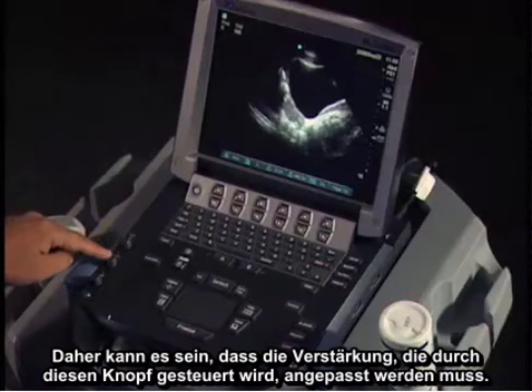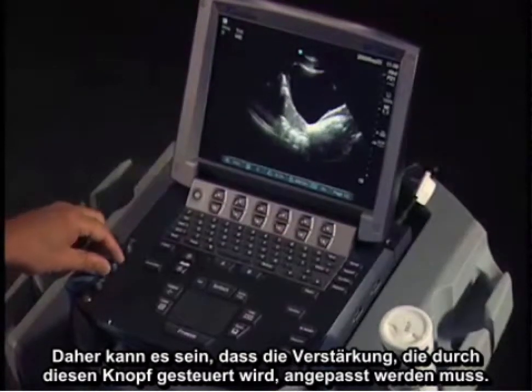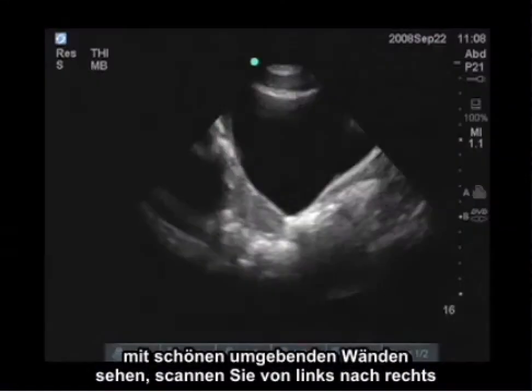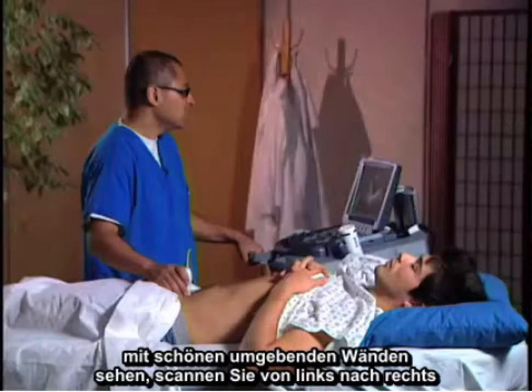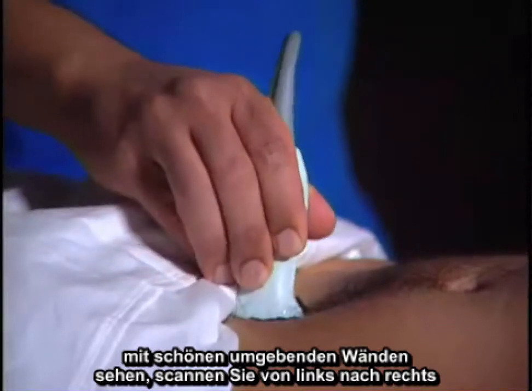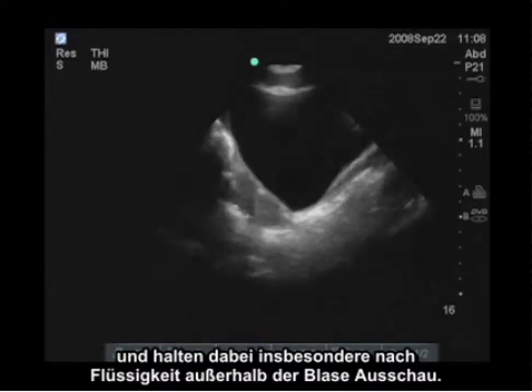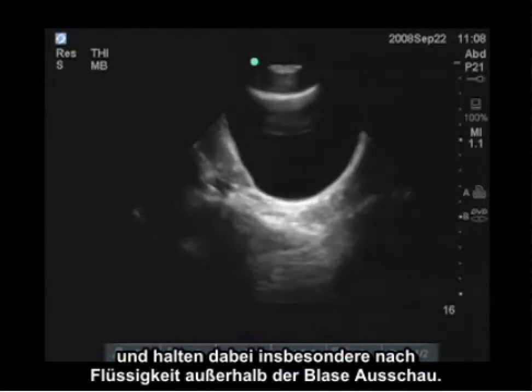The far gain, which is this knob here, may need to be adjusted additionally. Once you identify the bladder — which we see is an anechoic structure with nice circumscribed walls — you want to scan from left to right, looking particularly for evidence of fluid outside of that circumscribed bladder.